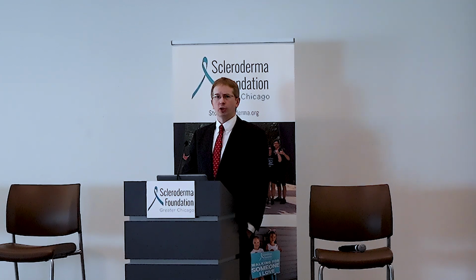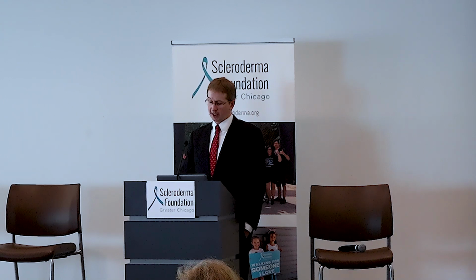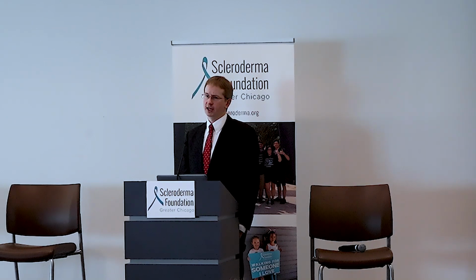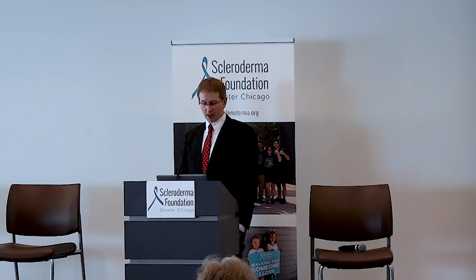Generally, like I said, inflammatory arthritis, I believe, is underdiagnosed in scleroderma. I think it is more than 5%. And the idea that 20% of our patients have it, as Dr. Fairchild found, sounds right to me. Osteoarthritis, of course, is common in everyone, but when it's present and you have scleroderma, that can complicate the assessment. That is something we can also determine from x-rays, but also dynamically on ultrasound.